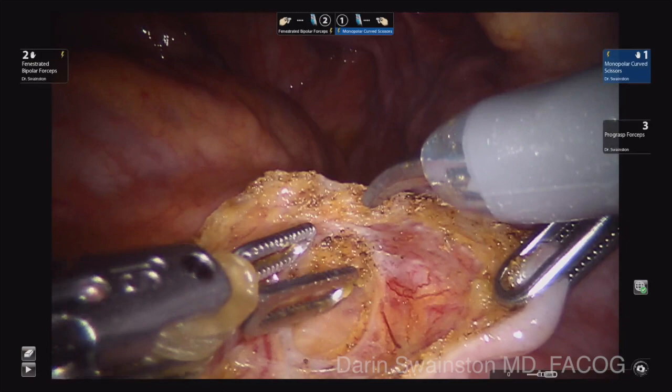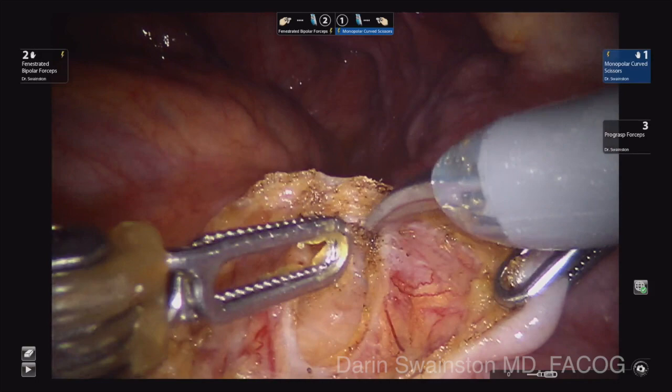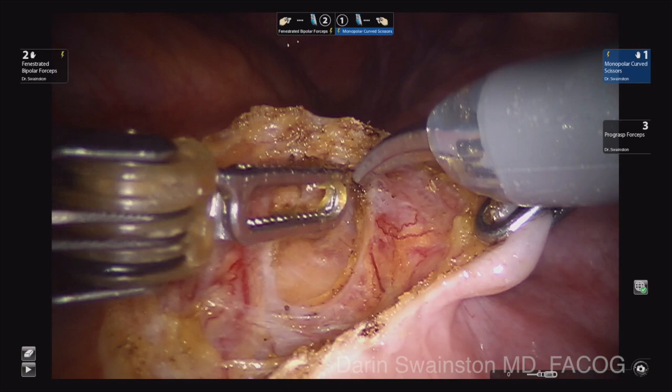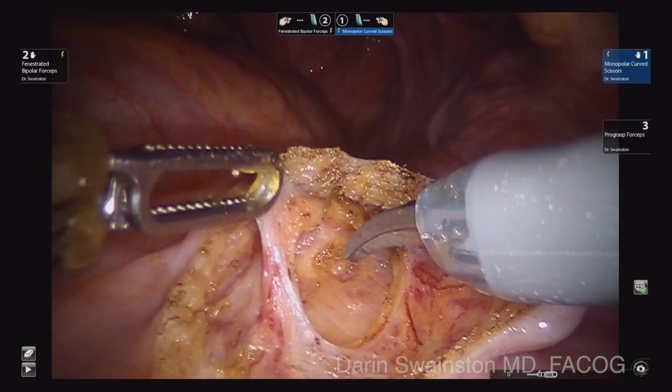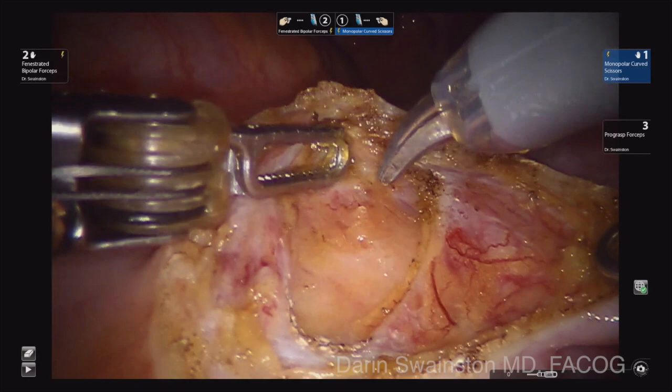There was minimal bounce in that area. When I tapped, I could see haptically that there was minimal movement in my left instrument. If I were to get a big bounce, I know I need to go either more medial or more inferior, away from those vessels. That area is a little soft, so I am going to take this vessel here, move it off to the side, and go a little bit more inferior.